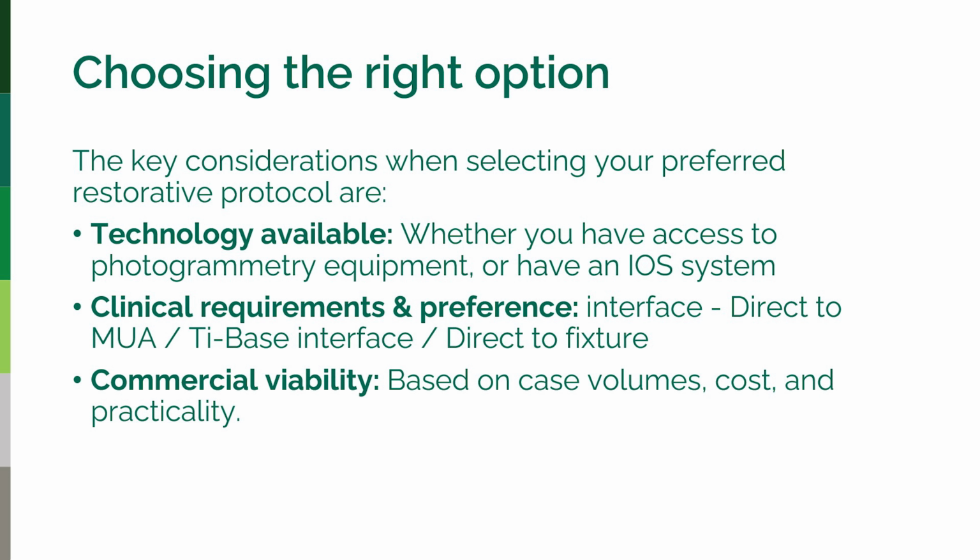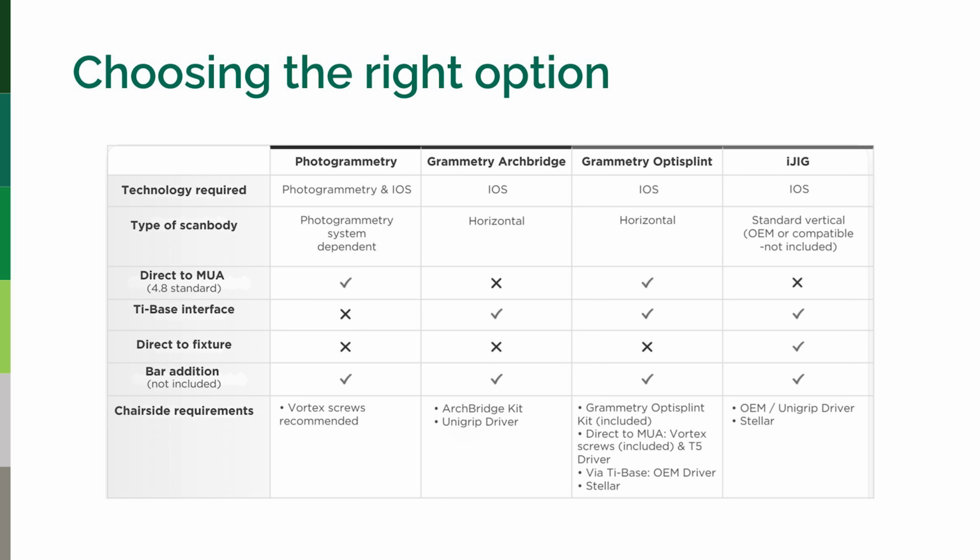And then you've got that commercial viability. What are your case volumes like? How much do you want to invest? Where are you digitally? Are you ready to take a step into the digital world and maybe build that trust in the process? We've created a little table to help with that selection process, which is available online.